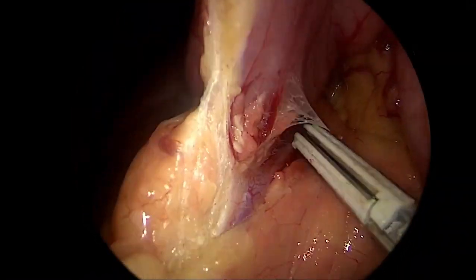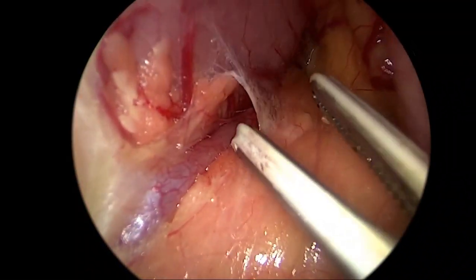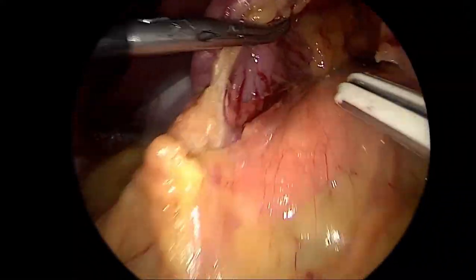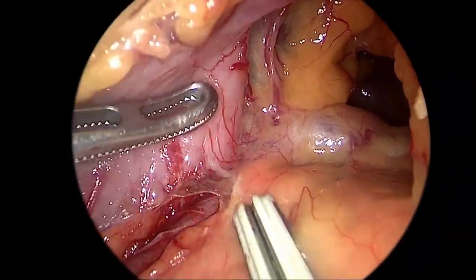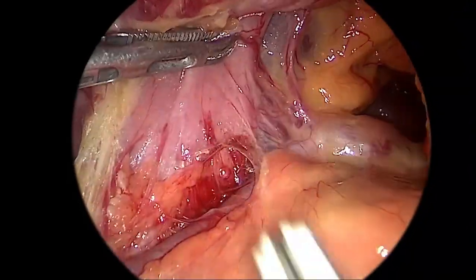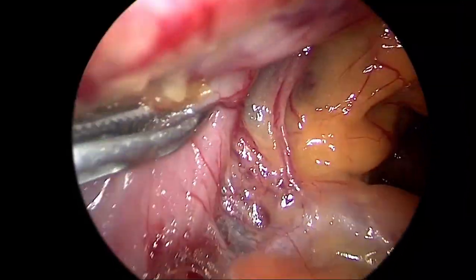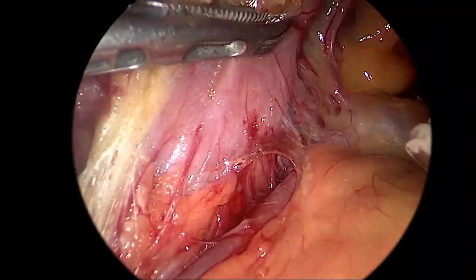I dissect parallel to the gastroduodenal artery till I have a window to encircle the first part of the duodenum. Verticalizing the duodenum, or elevating the duodenum up, you can see clearly here the common hepatic artery giving rise to the gastroduodenal artery and also to the supraduodenal artery. I dissect between these vessels so that I can have a window to encircle the first part of the duodenum.